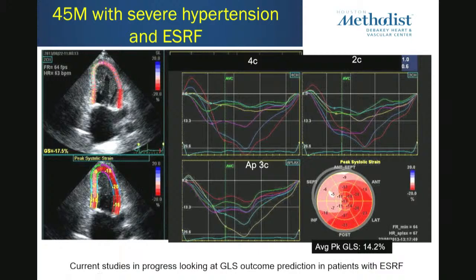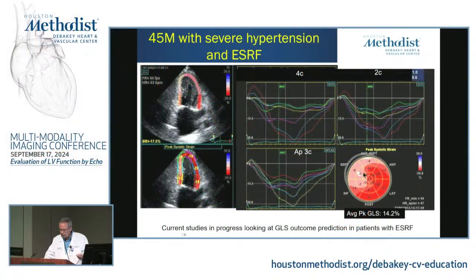Now, could that be an LAD lesion? Maybe, because it's covering this area here, or right here it is beginning to get into the right coronary territory. But you know what? This patient could have perfectly normal coronary arteries. This all could be intramyocardial, either because of myocardial coronary reserve issues or because of myocardial fibrosis and whatnot.